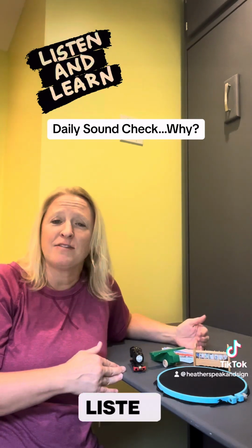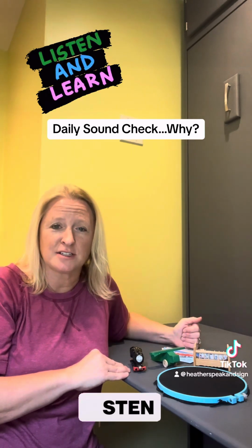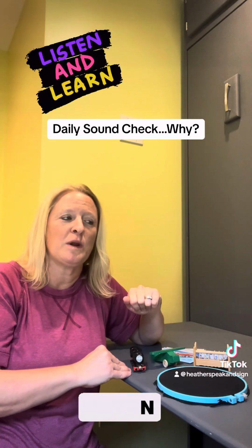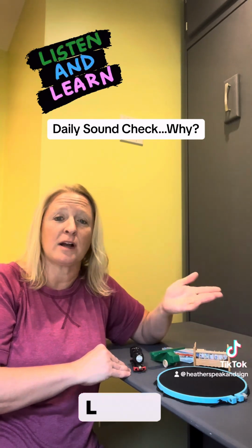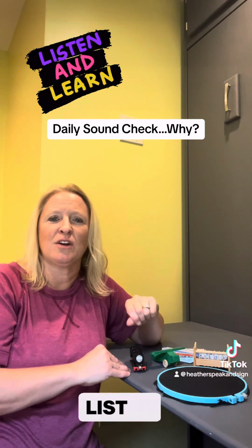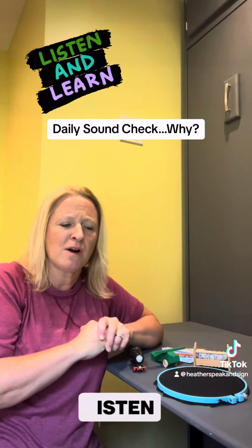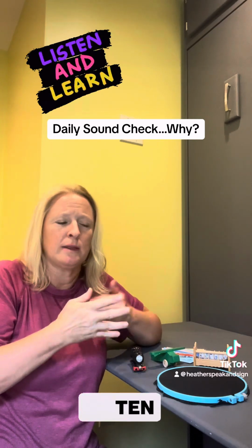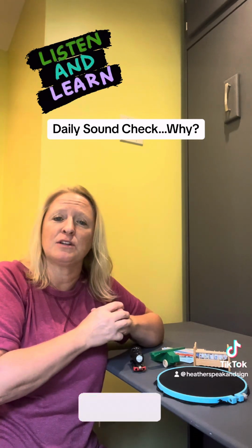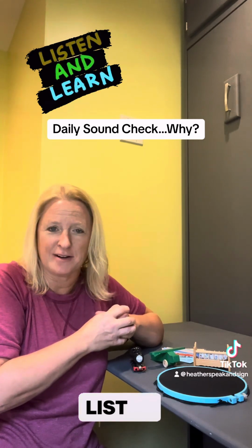We also want to have that data so that if that child is going to go see their audiologist, they're going to go get a new mapping, they're going to get their hearing aids checked, we need to be able to say to the family or directly to the audiologist, you know, when I'm working with them, they're not hearing that, is there anything we can do? Or every time I present the ooh and the ah, they're getting those mixed up. And maybe there's something they can do to adjust their equipment to help them access those sounds better.